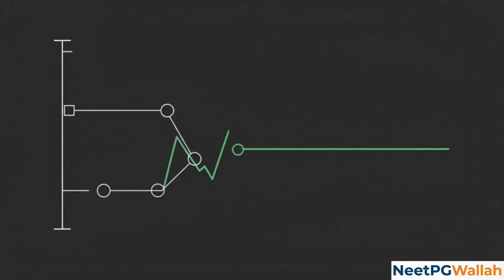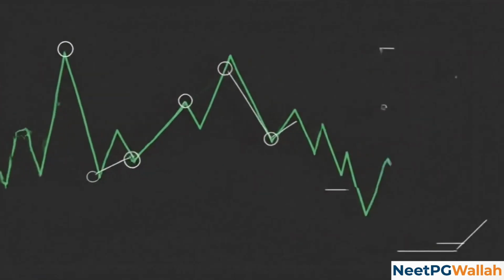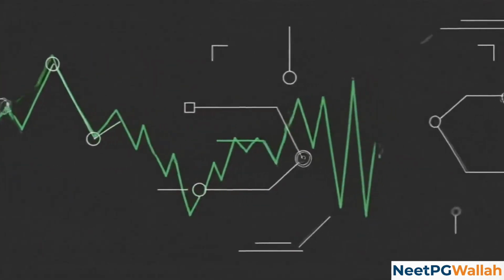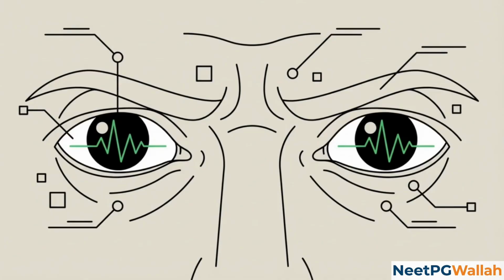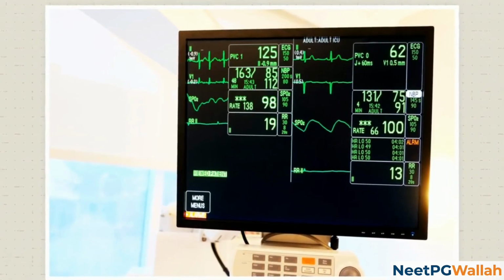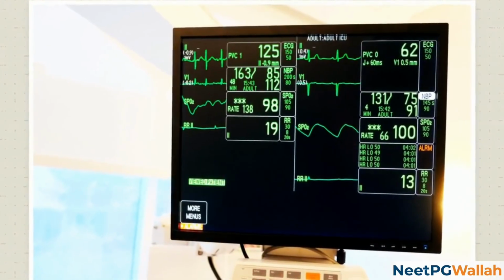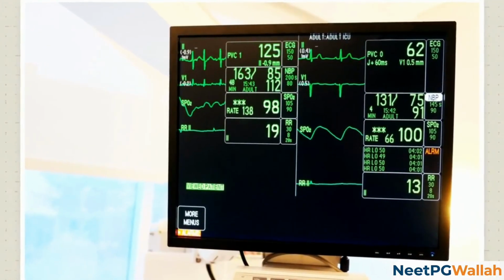Inside a hospital, the steady beep of a heart monitor is usually accompanied by an erratic green line racing across a dark screen. To an untrained eye, this looks like a stream of unreadable, high-stakes medical data. But for a medical professional, the chaos disappears. That jagged line is a legible clock, ticking away with absolute mathematical precision.